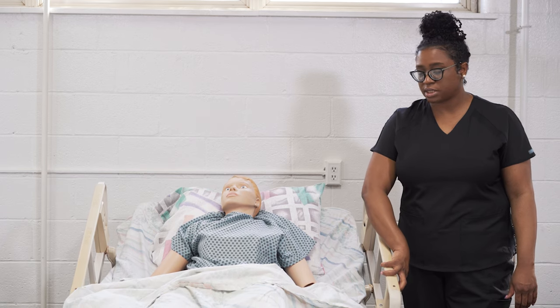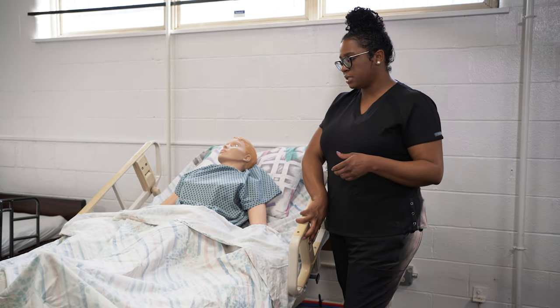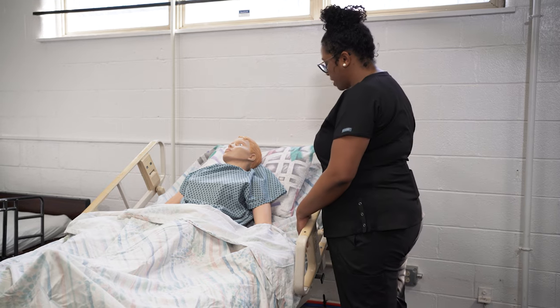Always be sure to let the resident know that you're moving the bed before you move it. And then once the bed is up to working height, we are going to lower the head of the bed. Ms. Smith, I'm going to lower the head of your bed.